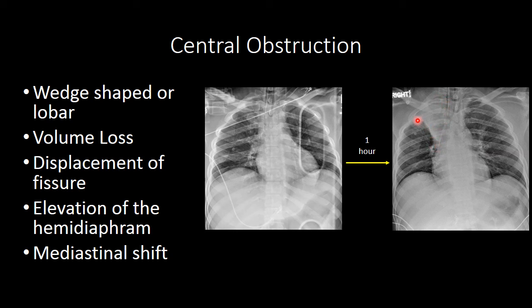How do we know that this is atelectasis? We can see that there is elevation of the right hemidiaphragm. Overall, the lung volume in this hemithorax is greatly decreased compared to the volume in the left hemithorax. Also, this smooth, demarcated line represents the major fissure that has been elevated due to right upper lobe collapse.